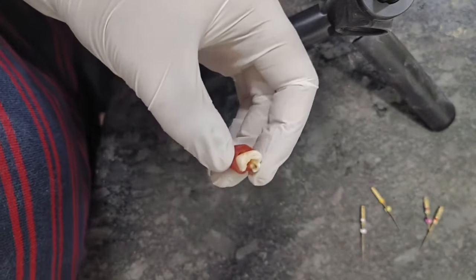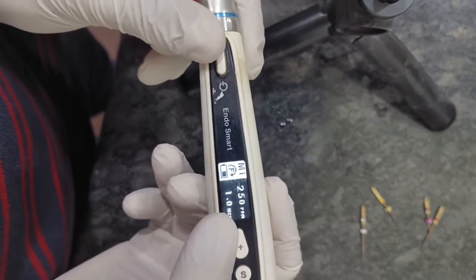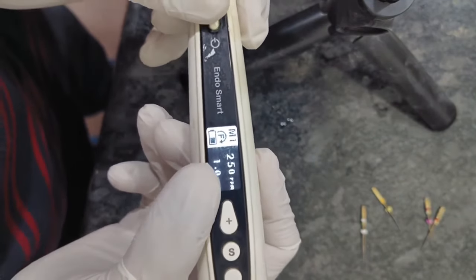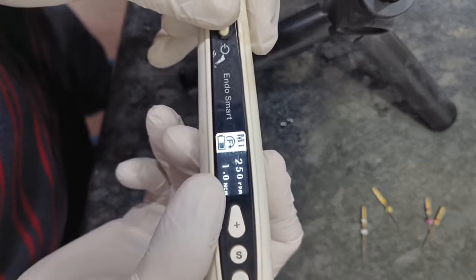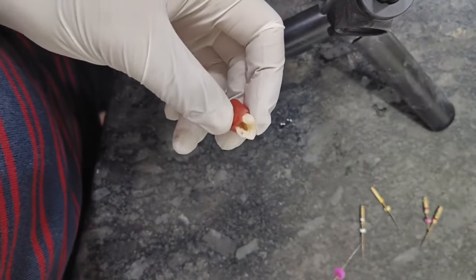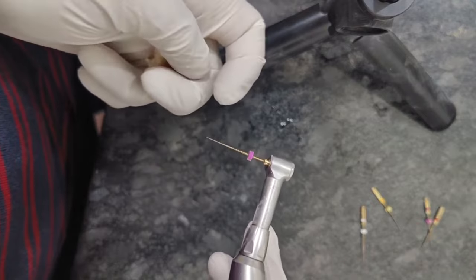Now we can set the working length to 19, and this is my demo endomotor in which I have set the speed for 250 rpm and one torque. Initially, for beginners, I would like to recommend that you use this 250 rpm and one torque. Usually the company's recommendation is 350 rpm with 1.5 torque, but initially if you do with this slow speed, it will be beneficial for you. And I have already explained the various files in the first part of the video.